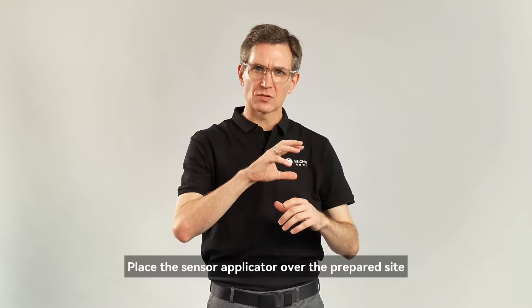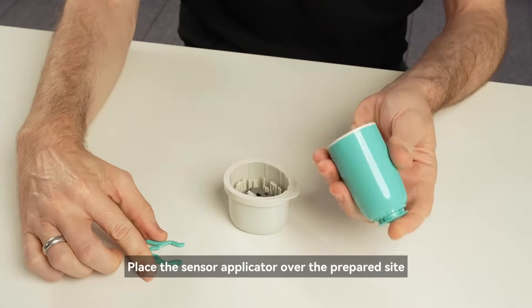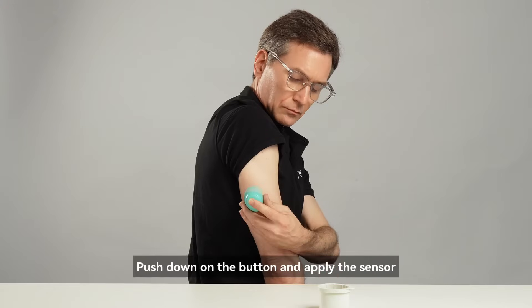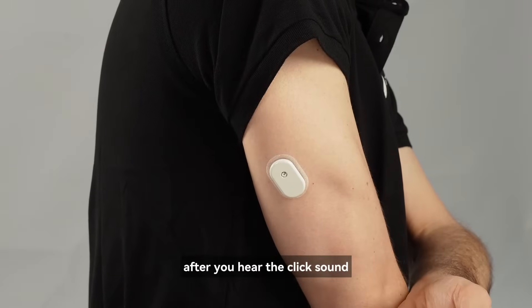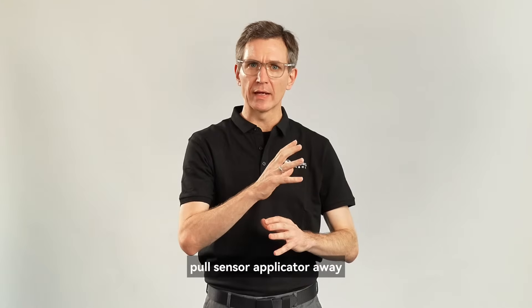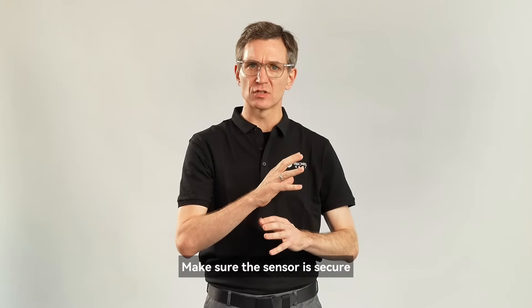Place the sensor applicator over the prepared site. Push down on the button and apply the sensor. After you hear the click sound, pull the applicator away. Make sure the sensor is secure.